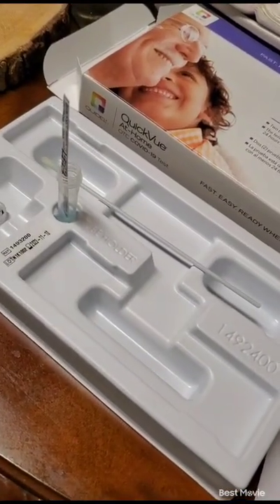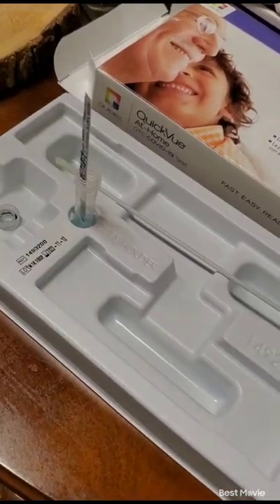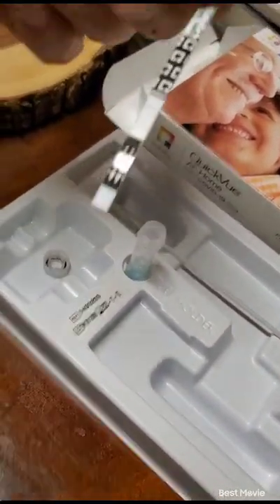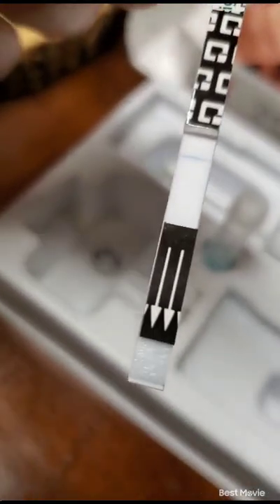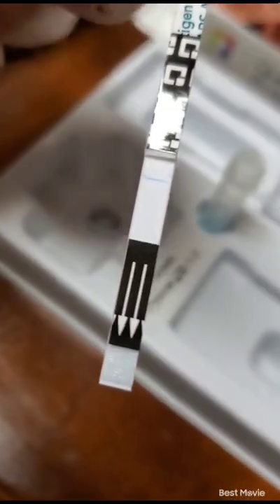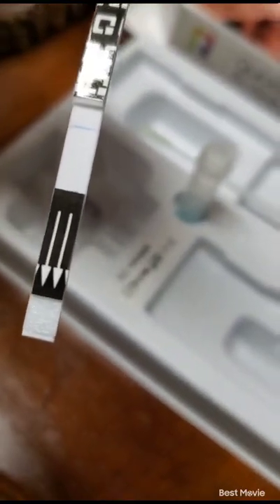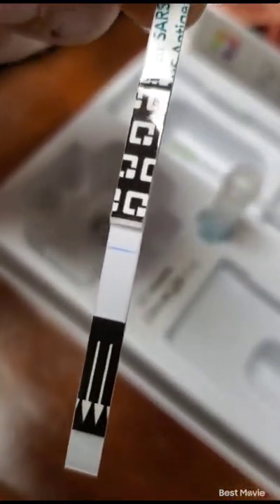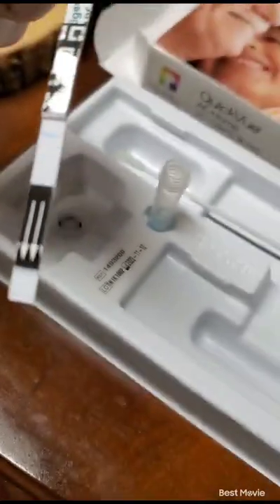So now the 10 minutes have passed and we're going to check the results. And as you can see, just one blue line, which means I am negative — no faint pink line, no pink line, nothing. Stay safe everybody.